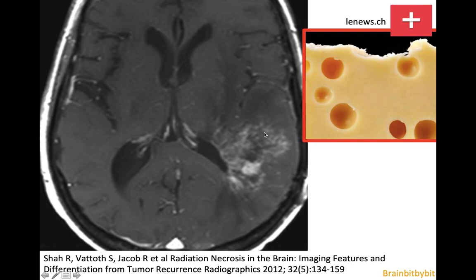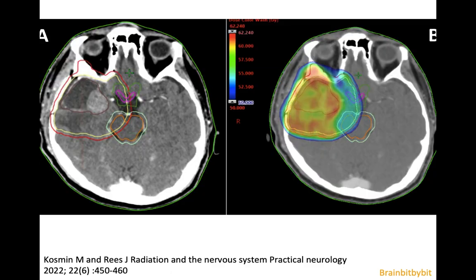In the case of a nasopharyngeal carcinoma, it's easy to detect that the changes in the brain are radiation necrosis, but if the primary tumor has been located in the brain, it might be more difficult. You can use advanced imaging techniques to distinguish radiation necrosis from recurrent glial tumors.